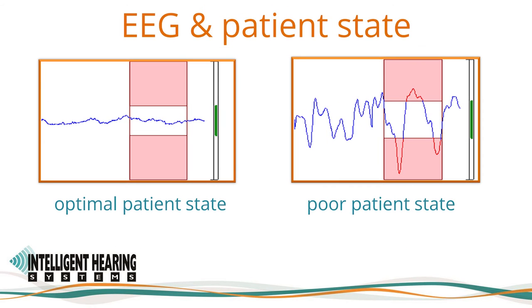On the left side, you will see an example of the EEG of a patient in a calm and optimal state, where the incoming EEG signals are small in amplitude and within the artifact acceptance region. The example on the right is for the EEG of a patient in a very active, poor state. The EEG signals are within the red shaded area, meaning they will be rejected.